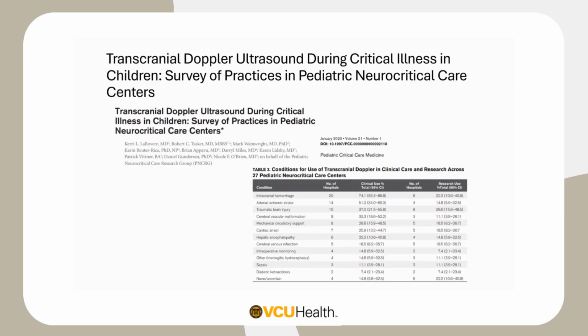When it comes to this, I think Virginia and Marina may have alluded to it, but we have a number of studies and surveys, and Delphi surveys, that have gone over who does TCDs and what our consensus recommendations are.